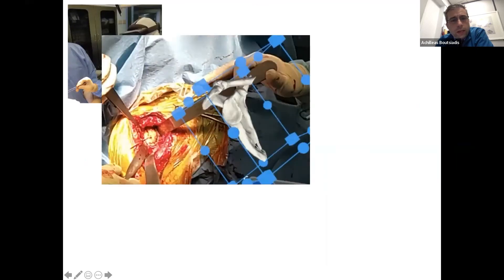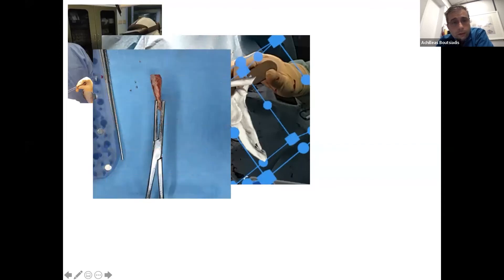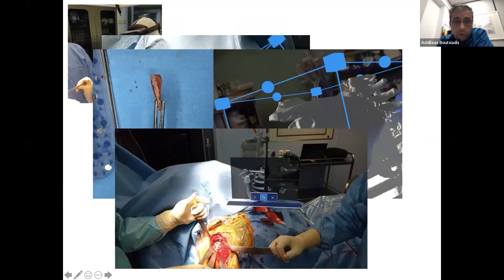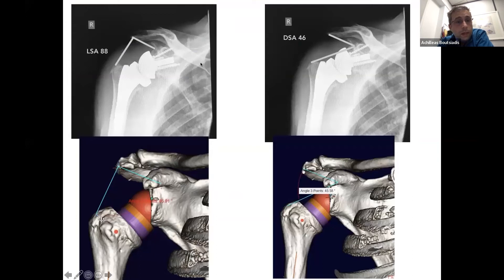Intraoperatively, in this case, this is the placement of the first guide wire, and we have the CT scan of the patient as a hologram. This is the bio-RSA that we measured — it is six millimeters. We can project our bio-RSA onto the hologram, which is very useful. This is the final position of our base plate. In the mixed reality view, you also have the images in 3D and in two planes — transverse and axial. For the same case: the final LSA was 88 degrees, planned preoperatively as 85.9 degrees; and the DSA postoperatively was 46 degrees, planned as 45.5 degrees.